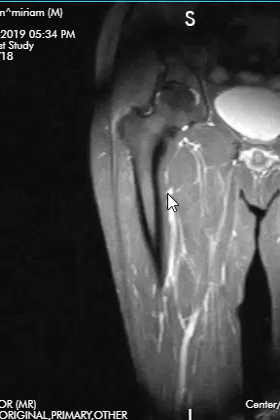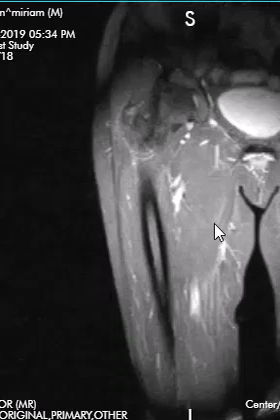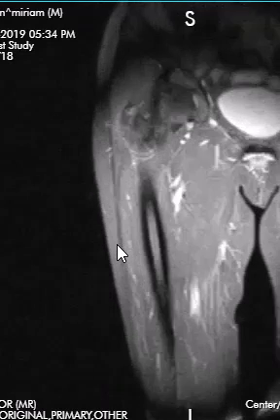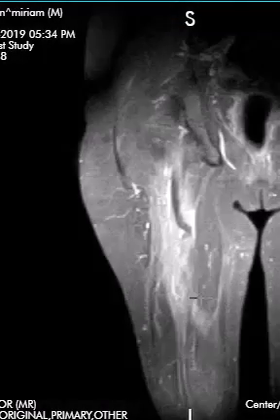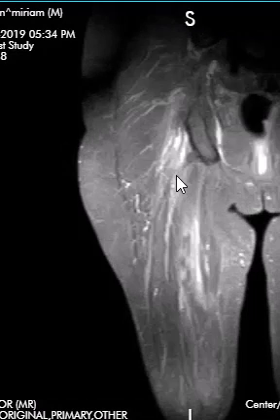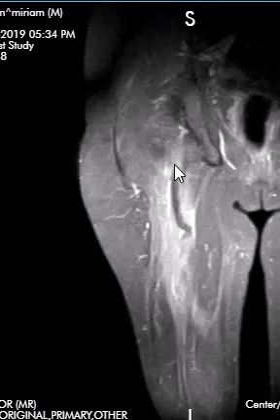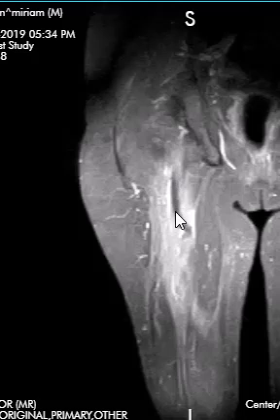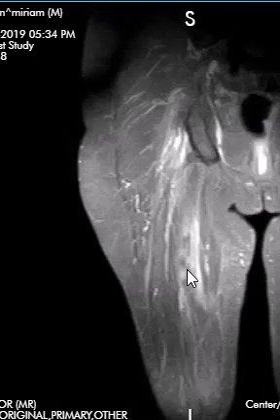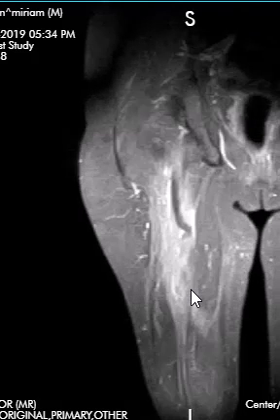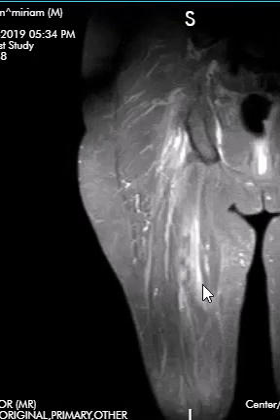This is a view where we can see the thigh - this is the medial thigh, lateral thigh - and if we go towards the posterior aspect into the hamstrings, we see that there is a tear. It's retracted about three centimeters or so. The tendon ends about right here, comes down, and it's recoiled upon itself, kind of wiggly, and you can see edema or hemorrhage surrounding that.